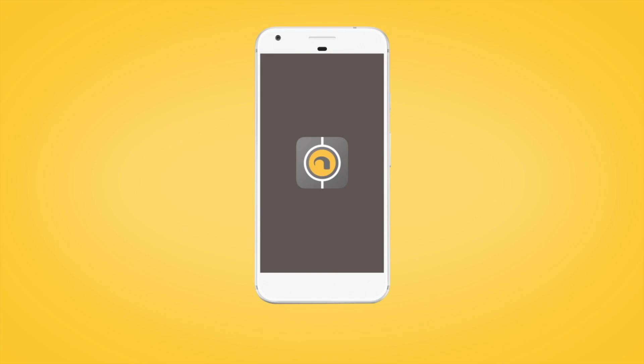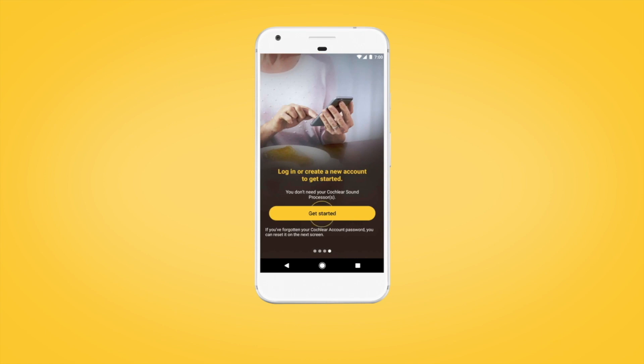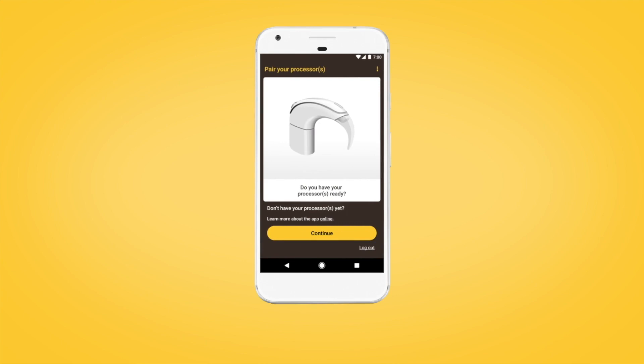Open the Nucleus Smart App and swipe through the welcome screens. When prompted, create your Cochlear account or log in if you already have an account.